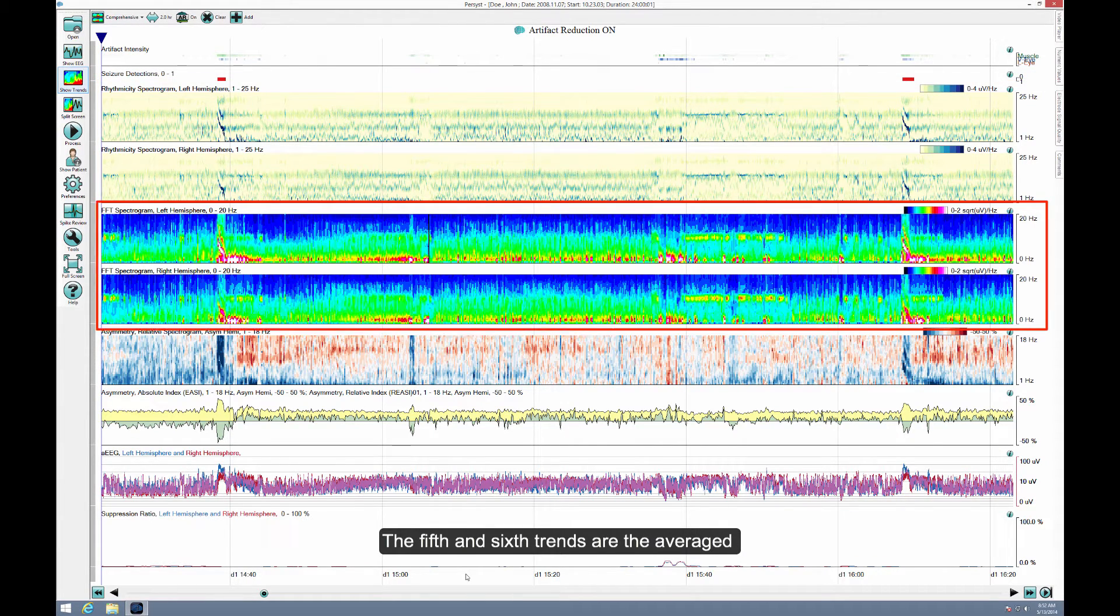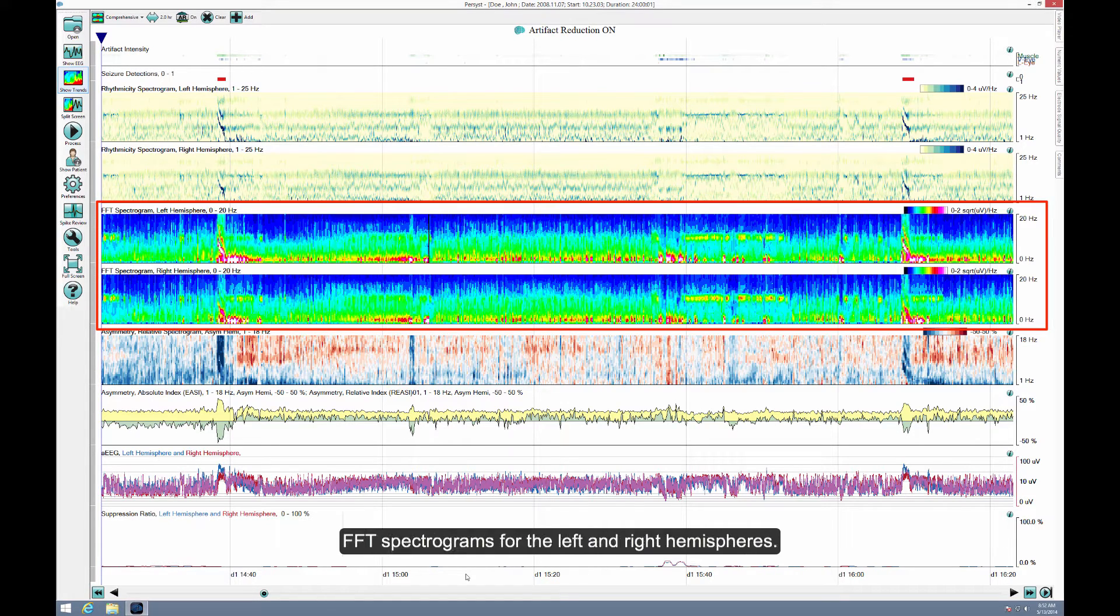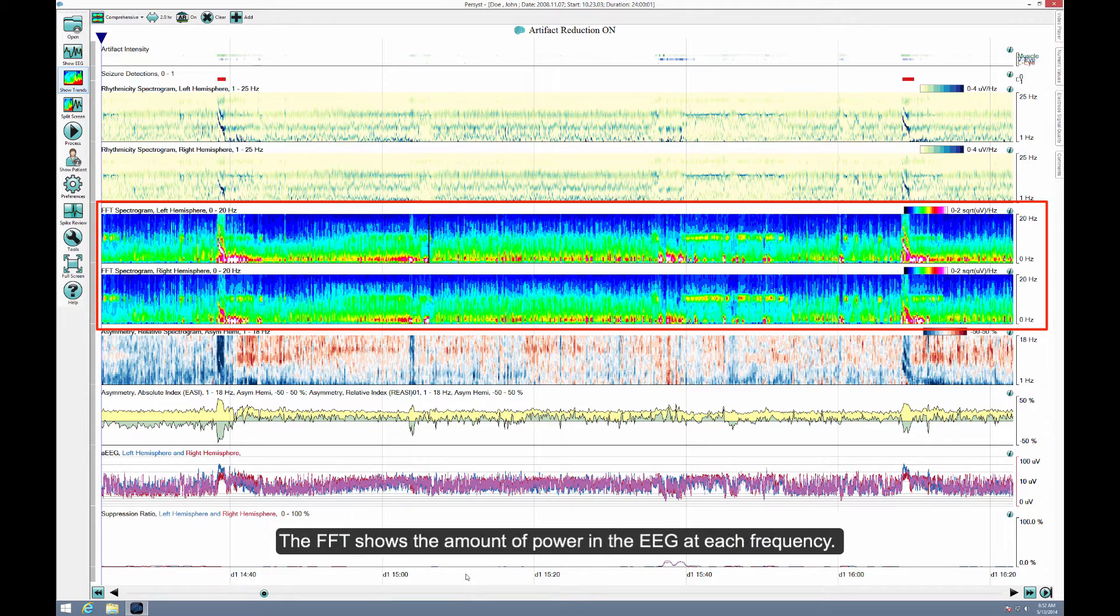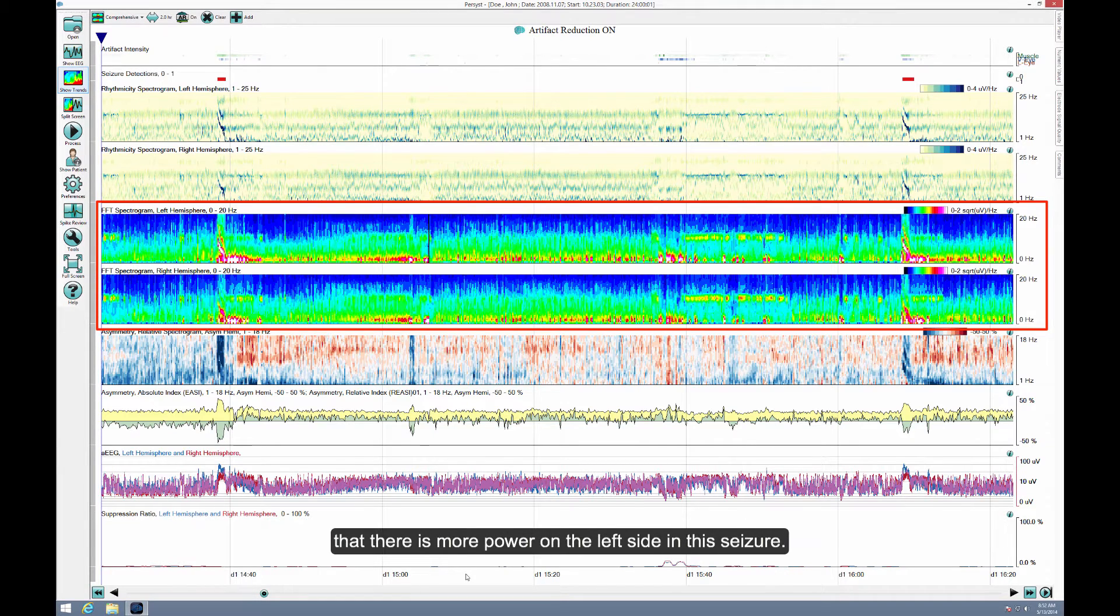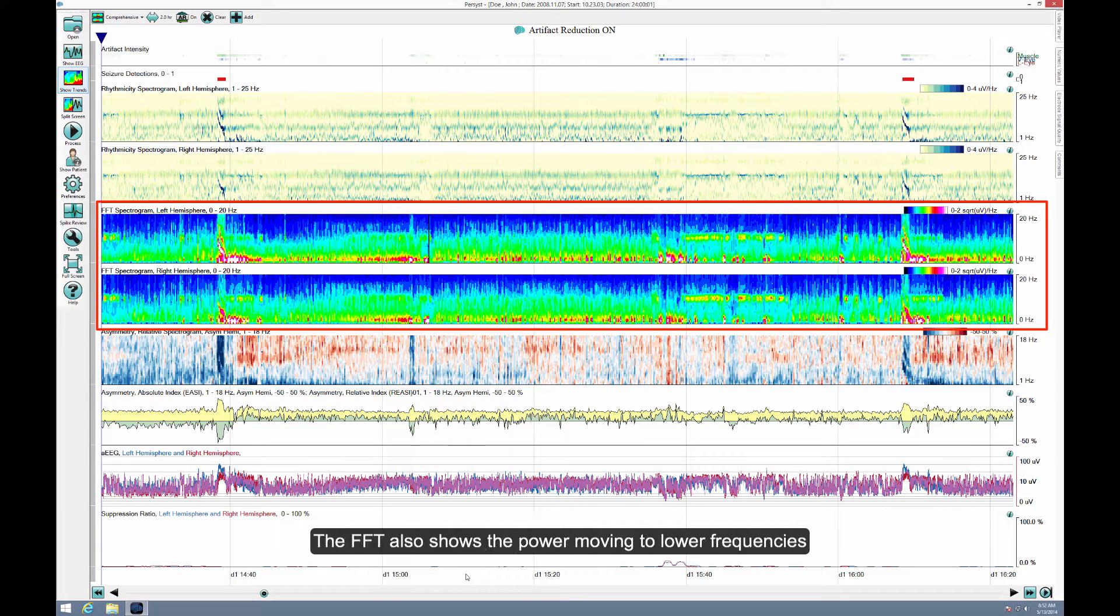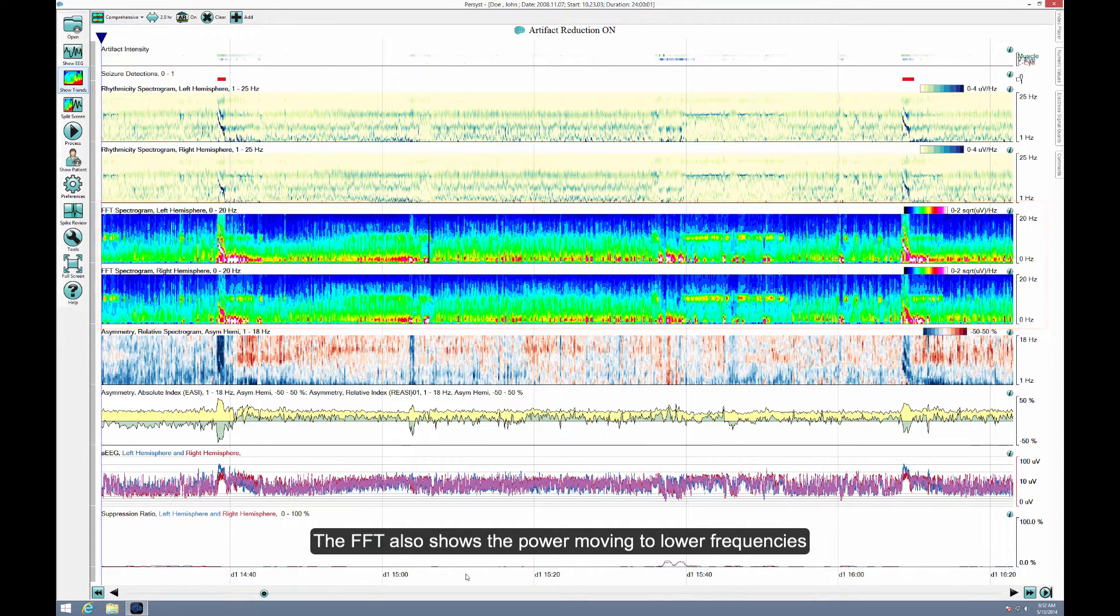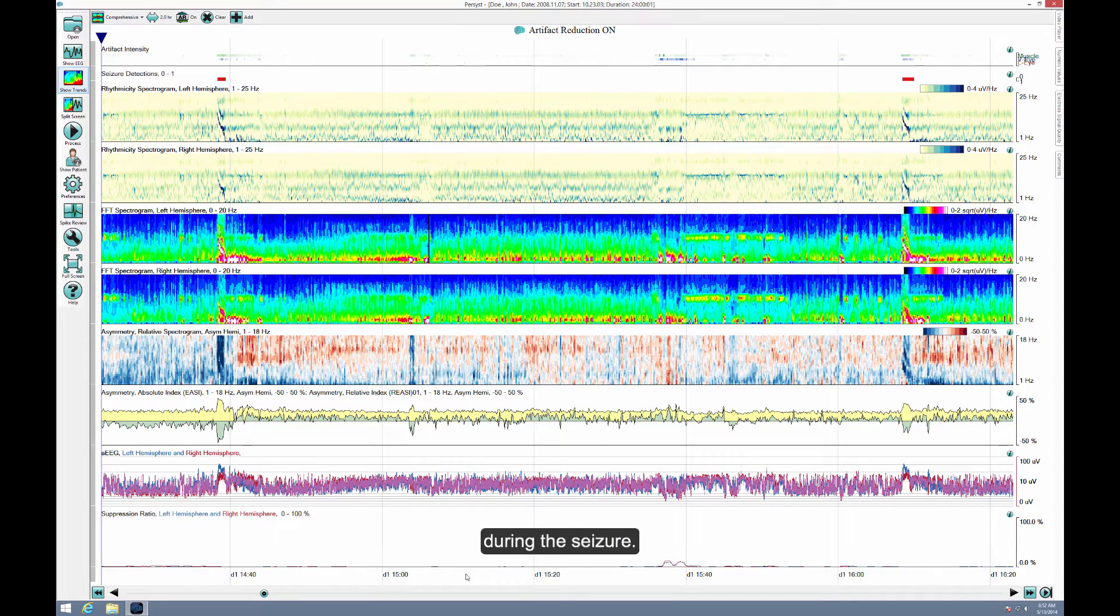The fifth and sixth trends are the averaged FFT spectrograms for the left and right hemispheres. The FFT shows the amount of power in the EEG at each frequency. Both the Rhythmicity and FFT spectrograms show that there is more power on the left side in this seizure. The FFT also shows the power moving to lower frequencies during the seizure.